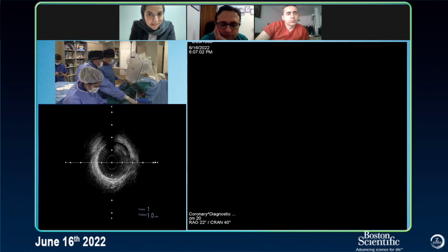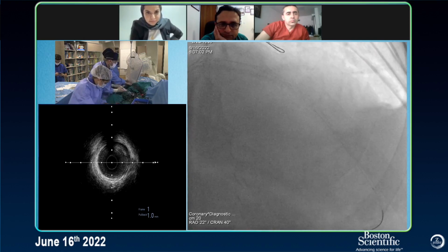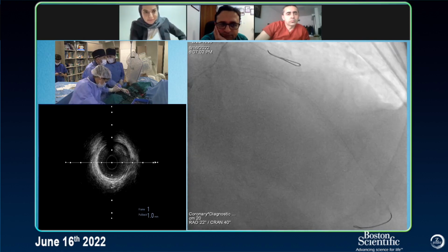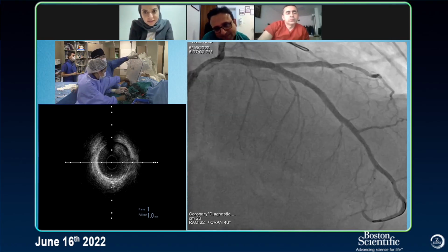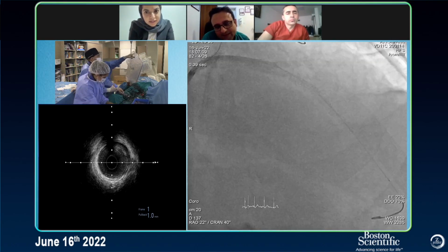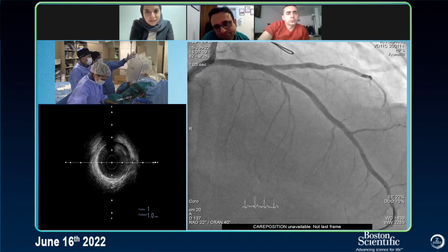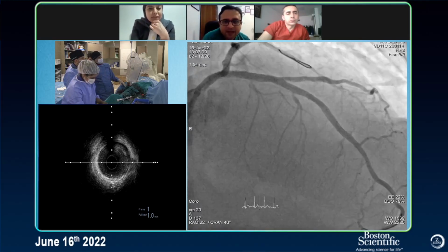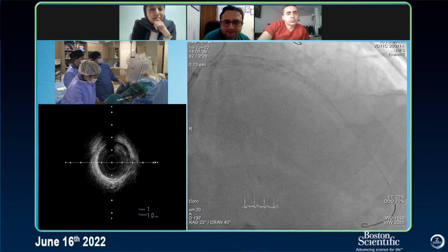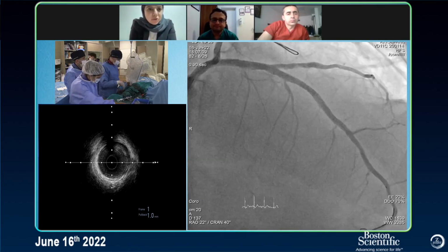Let's see. If you want me 3.5, it's better for me because then the risk is less. Yeah, I know. And you will be happy, that part, you see, I hit it 3.5 big balloon, I'm sure. We can do again once more. I'd probably take high pressure short 3.5, or 3.75 or shorter.